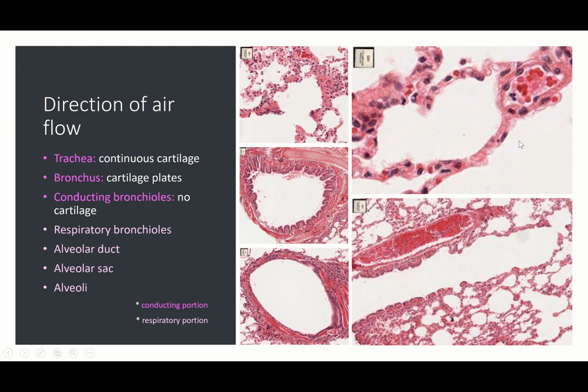And so you can see how the walls, so this would be like one alveoli, one little ball, and you can see how it's just one cell thick, right? It's super thin, the lining, and then we've got a blood vessel right here. So we have gas in these alveoli, we have blood in this blood vessel, and here is where our gas exchange is going to occur. Or, well, I guess it would happen at the capillary, sorry. Right here is where gas exchange would occur. That's a little arterial, but anyways.